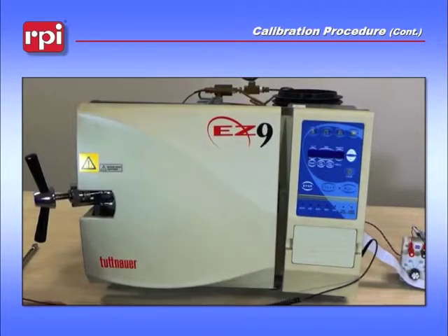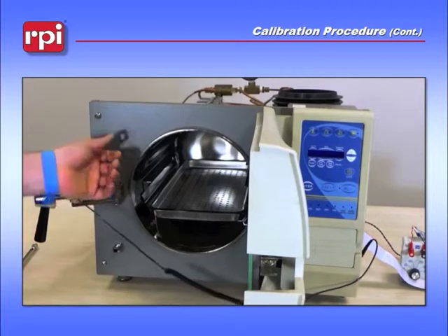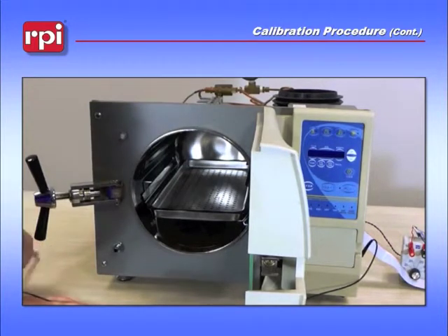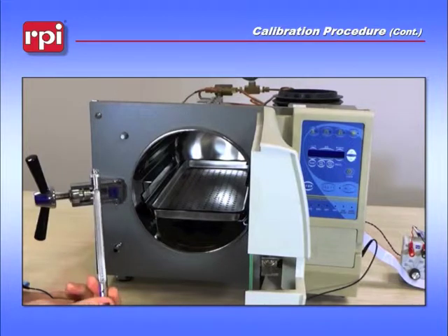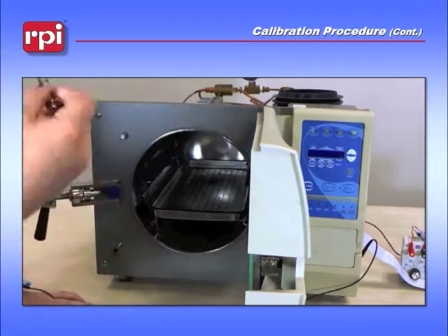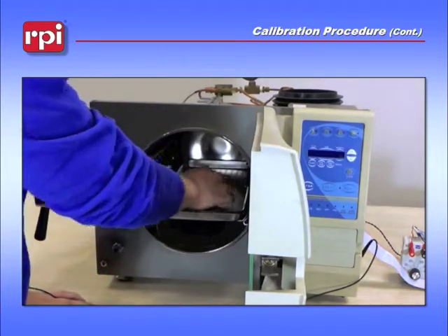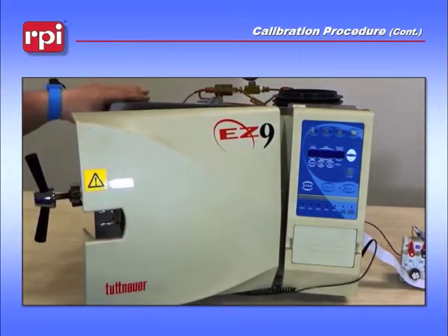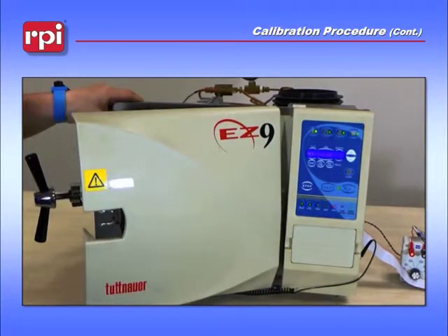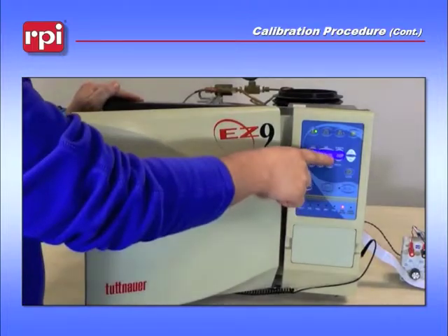The next part of the calibration procedure is to do the zero pressure adjustment. Open up the door and hold in your door switch for 5 seconds while you power the unit on. While you are here, grab your RPT-113, which is your max register thermometer, and place it on a tray inside the machine. Shake it down so that the thermometer reads 150 degrees. Press on the door switch, turn the unit on, keep holding the door switch for 5 seconds, then release it. Once finished, you should see zero pressure on the display.